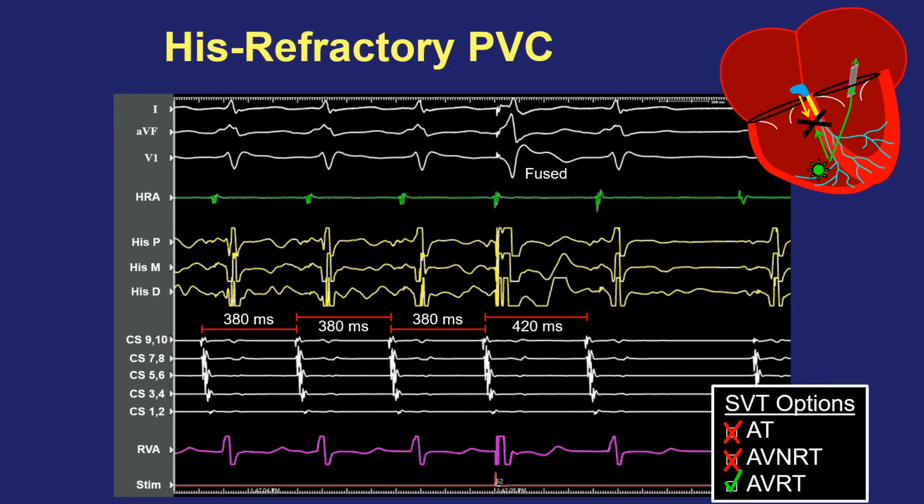altered the tachycardia circuit just enough that it kind of peters out and actually refractory periods occur the next time round. Maybe you've hit this fast enough that the next time the circuit comes round, the accessory pathway is fully refractory and terminates, which appears to be what occurs here, because you had an A, you got back down to the V, and then you failed to get back up to the A. So the next time round, this was fully refractory and probably caused by that PVC, which altered things just enough to terminate it.